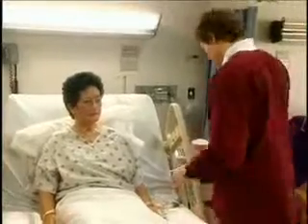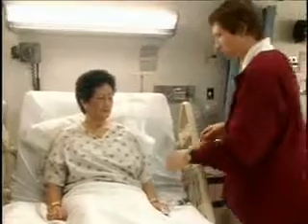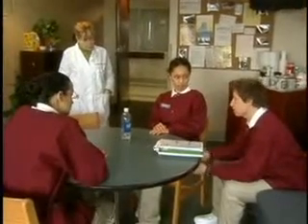Well, I checked the oxygen system, the flow meter, the tubing, the connections for patency, and then I used the earlobe sensor. And then what? Okay, well, remember I said there were irregular meter pulsations, right? Well, the patient has peripheral vascular disease, which I didn't take into consideration. So the circulation in her hands is compromised. So once I used the earlobe sensor, the reading was 96% on her oxygen, which was right in line with my original assessment. That's it.